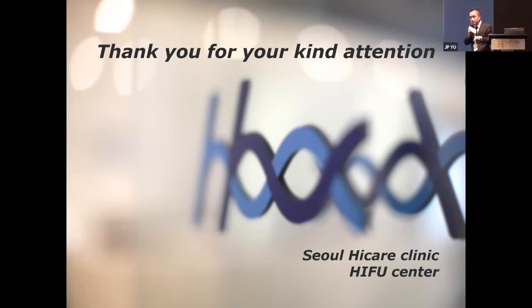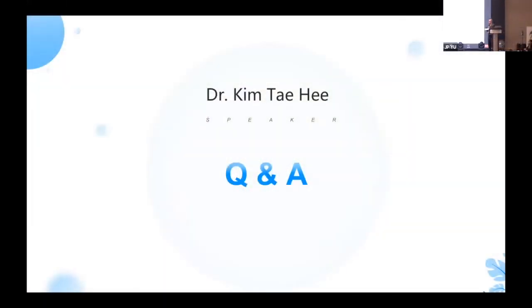So this makes a safer procedure. My recommendation is to use Sonazoid with a rectal polyballoon to treat uterine fibroid or adenomyosis. Thank you.